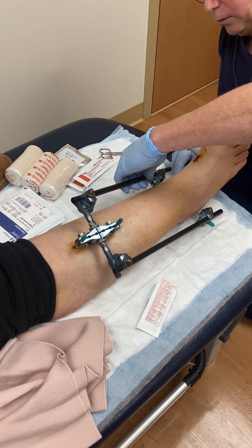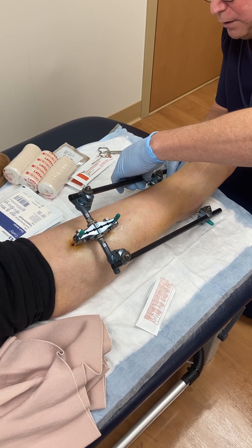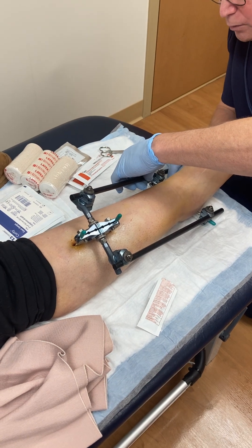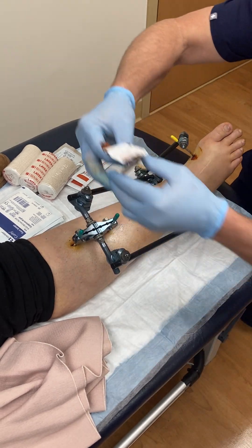Once we're done cleaning all of those pin sites, we really want to clean all the pins. We're trying to push the skin towards the bone and clean the pin so it doesn't have any material building up on it.